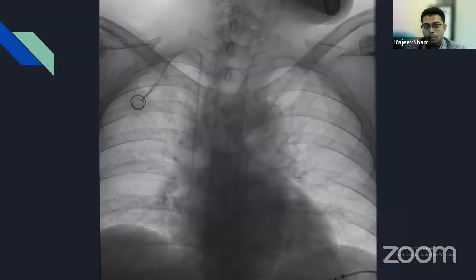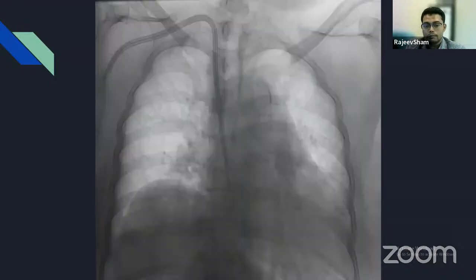This is a chemo port. As the name goes, it is used to give chemo drugs to a patient, in a cancer patient for example. This is a tunneled permanent catheter for dialysis patients. Sometimes they are waiting for the fistula to mature, so they might need to have this for their dialysis before they can use the fistula.